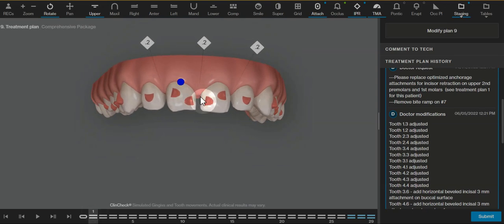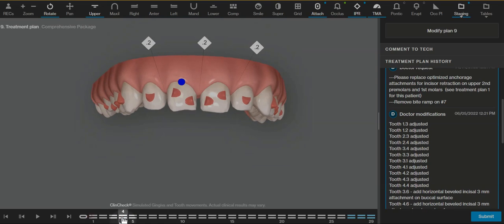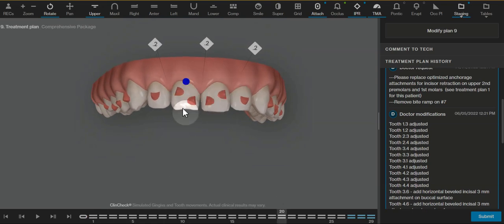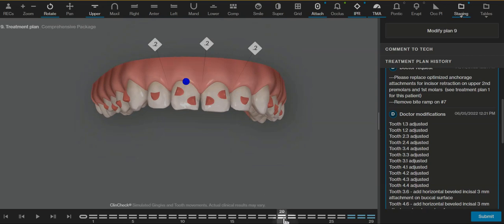You would end up with more of a black triangle right here and the root would be leaning far distal. So by adding these root control attachments, that helps guide these teeth to the center and I am trying to push that root over to the mesial so it doesn't end up with a black triangle.